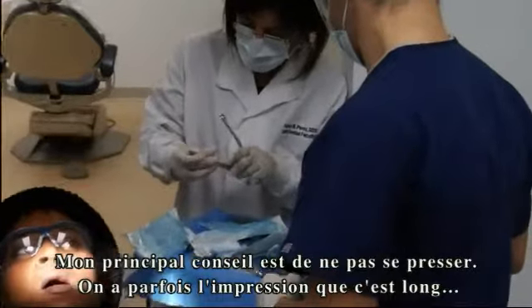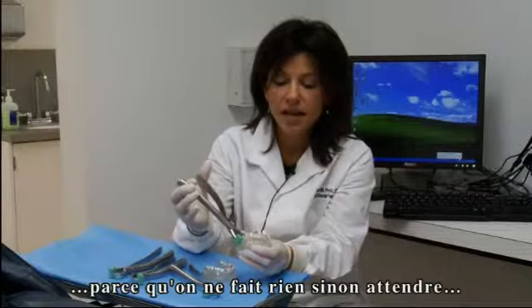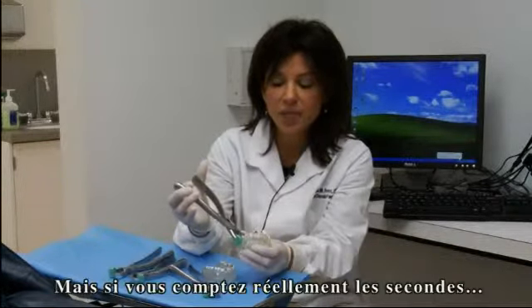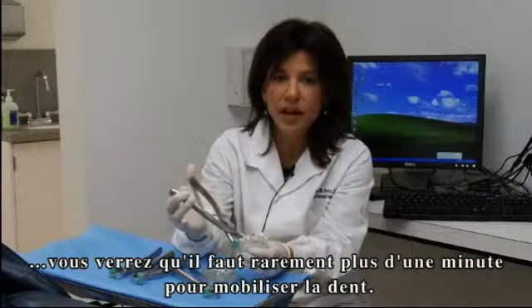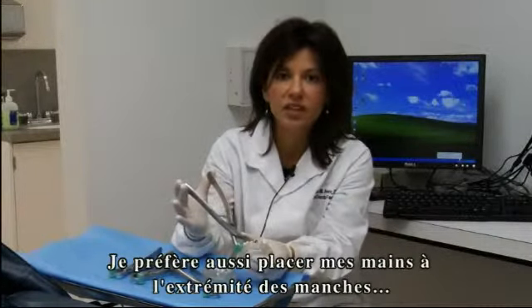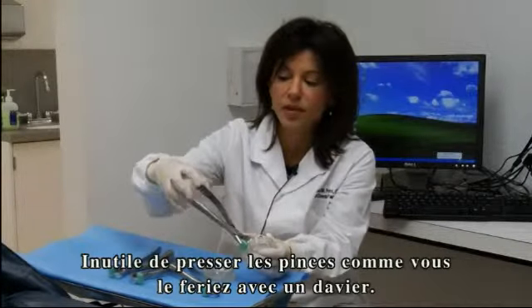Some good tips would be to go slow and not try to rush the procedure. It feels like it takes a long time because you're not doing the multiple movements used with conventional forceps — you're simply holding a resistance on the tooth. Even a few seconds may seem like a long time, but if you count to yourself, it rarely takes more than a minute to get movement of the tooth out of the socket. Just be patient, hold the pressure on there, and remember not to squeeze. Being very far back on the handles helps a lot because it increases your leverage and makes the forceps work more efficiently. You don't want to choke up on the handles — you want to be very far back.